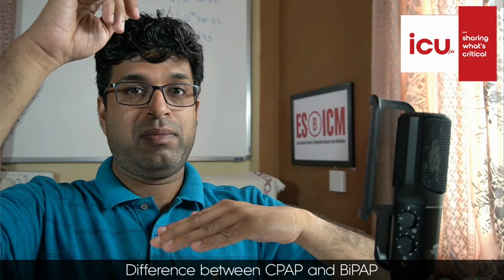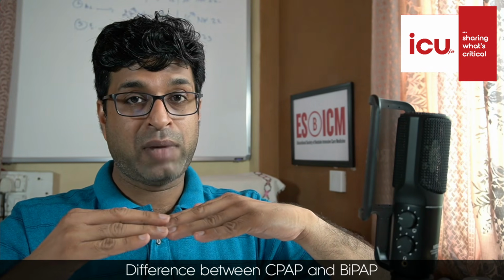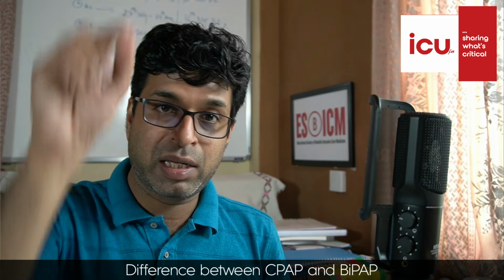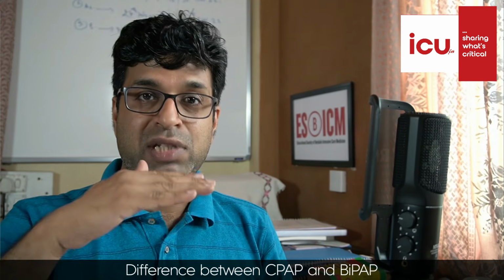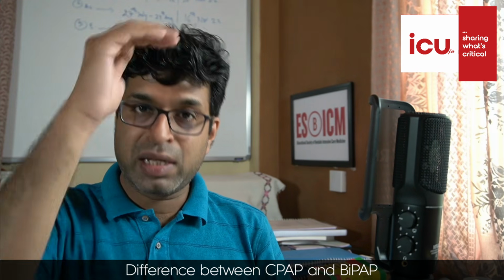This is your IPAP, and in the expiratory phase the pressure drops by the BiPAP to EPAP level, and now I can exhale properly. So in inspiration there is an increase in the pressure which helps the oxygenation, and at the end of expiration there remains a minimum pressure which doesn't allow the lung to collapse, but it allows the lungs to get emptied. It releases the pressure. So EPAP remains at continuous pressure, and IPAP increases during inspiration and decreases during expiration so that I can exhale.